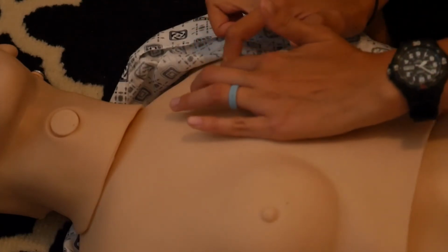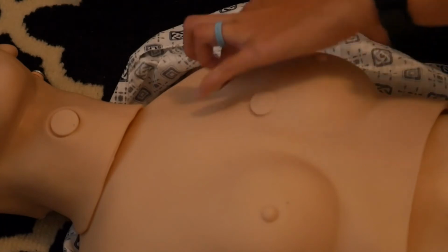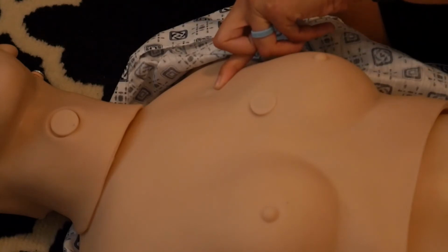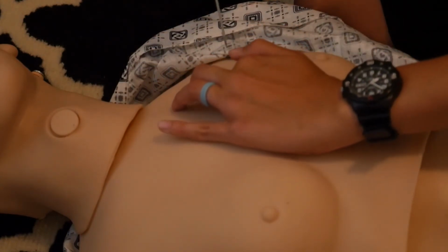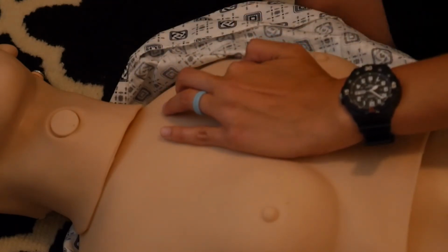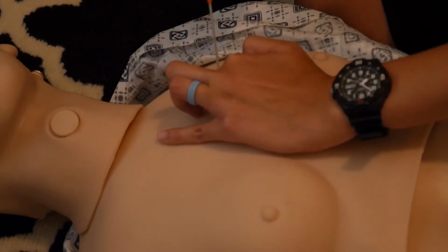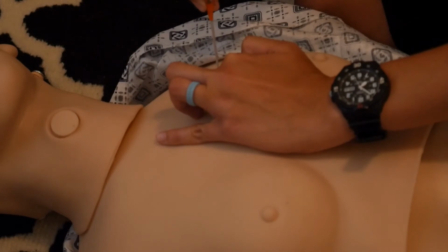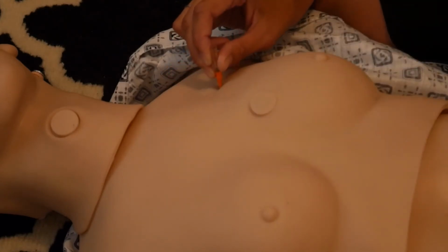Okay, so you want to palpate and identify the site. So I've identified the site, remove the needle cap. You would clean it, right? You want to hold it perpendicular to the chest, just right above the third rib, and you want to bury the needle down to the hub. Okay, so you want to wait for 5 to 10 seconds.